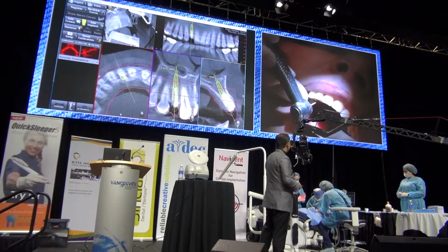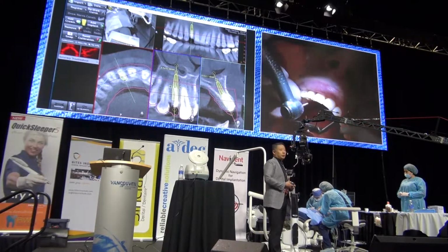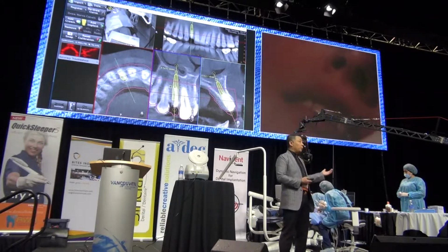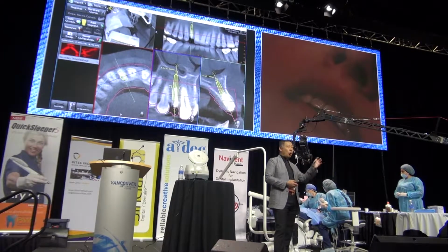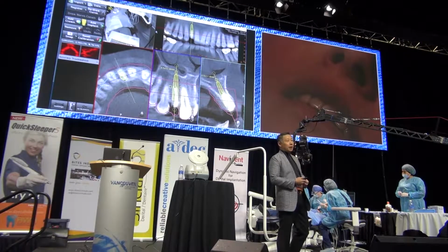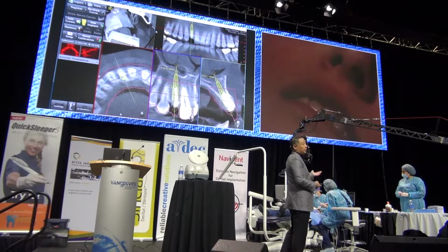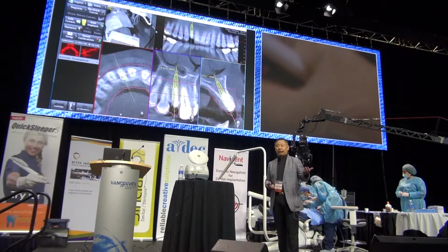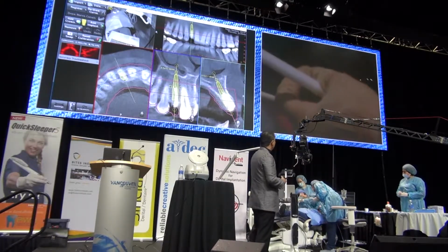Plus, you have to have multiple surgeries. So patients obviously would appreciate if you don't have to go through a staged approach. Enough studies have also shown that an immediate protocol where you preserve the hard and soft tissue, you have the best chance at holding the mesial distal papilla, the free gingival margin on the buccal, and of course you speed up the appointment down to half the treatment time, about 4 or 5 months. In addition to that, patients love you because you don't have to, again, have multiple surgical procedures.